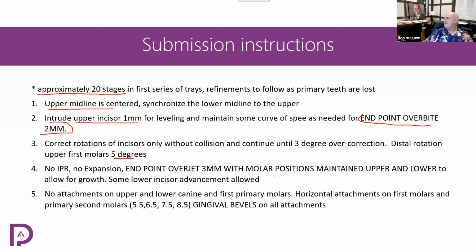But you cannot make appliances from that. Okay? The answer is yes. And you can actually do it right now. It's their ortho simulation app. And then when you see what we do, oh my gosh. Oh, and by the way, that's in Medit Link, which is free. You can all download Medit Link, use any scan from the scanner that you have right now. It should accept it. If it doesn't, let me know, and I will tell you how to do it.